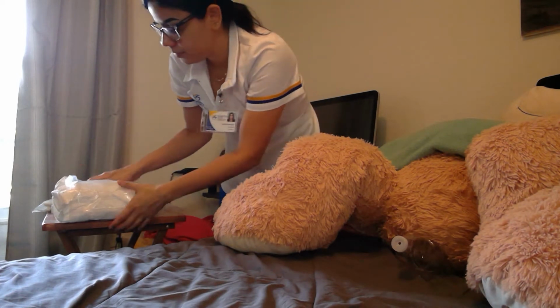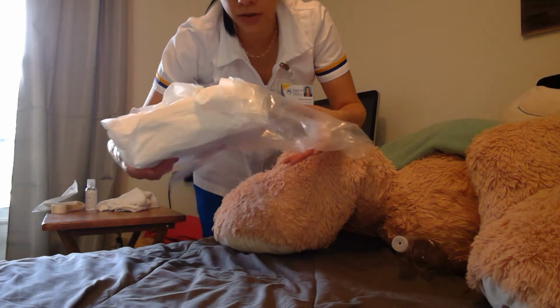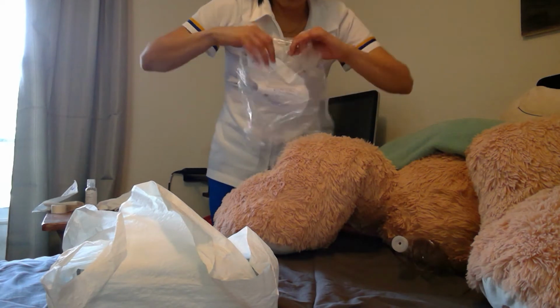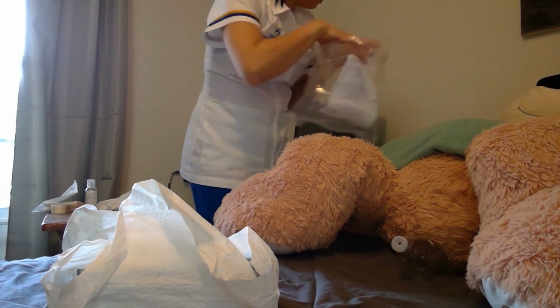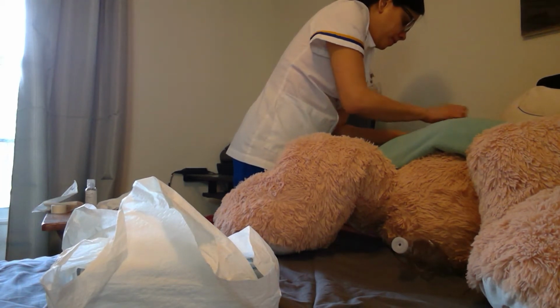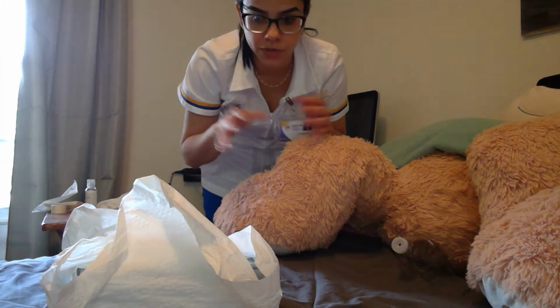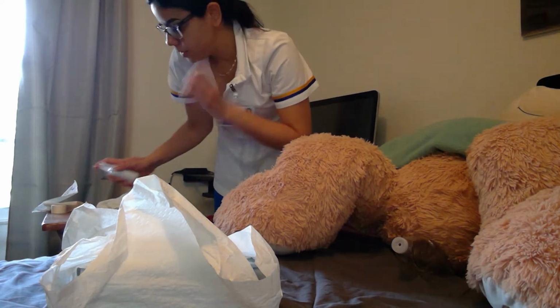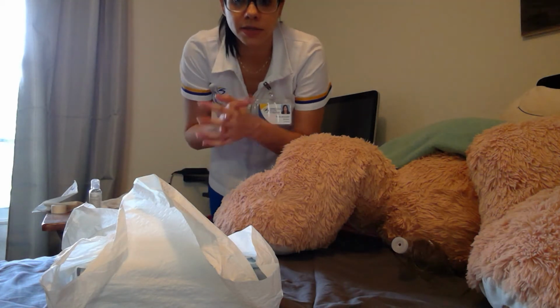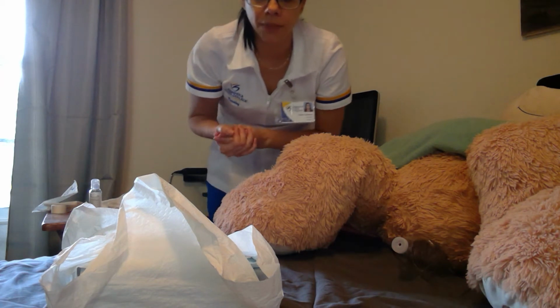So what do we have here? We have our tray, all of our stuff in here. So we're gonna take our tray out of the bag and put it here. Now this bag, we are going to put it here, on top of the head of the bed, because we can use that as a garbage bag later once we start opening our stuff. Okay, so hand hygiene, we're going to start opening. Always be aware that once we open, everything that's in there is sterile. Okay, so we need to keep it that way.